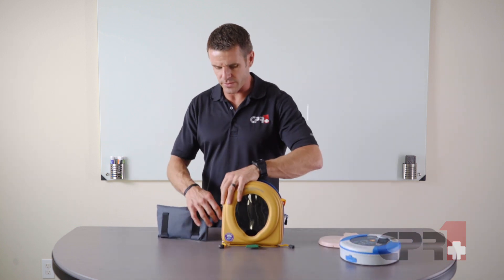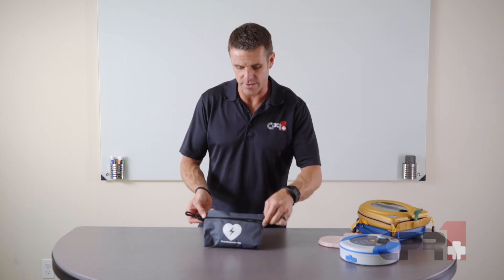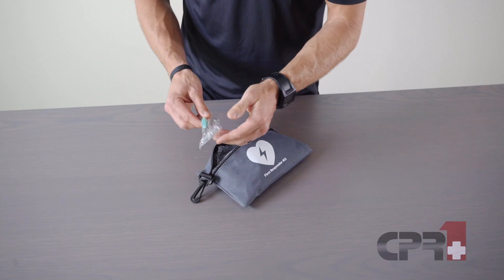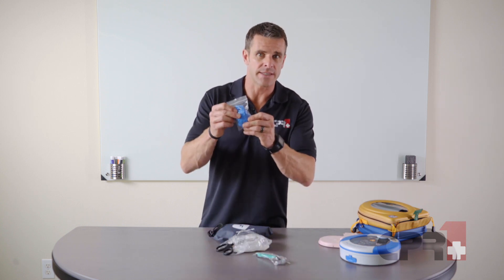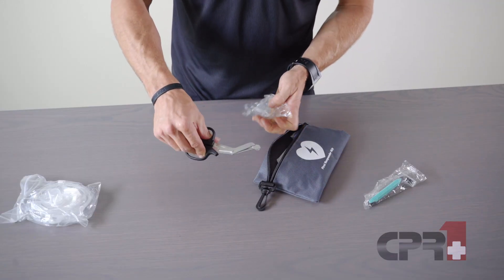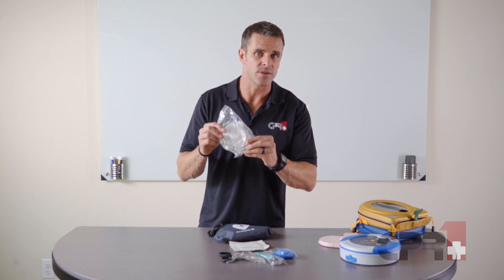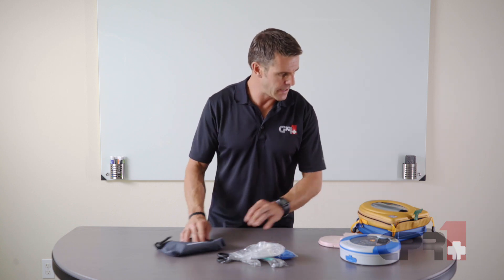Attached to the AED, we're always going to have a first responder kit. These typically have the same sorts of supplies regardless of the kit type, and it's always going to include a heavy-duty medical-style razor to shave the areas on the chest where the pads go if needed, a set of non-latex gloves, trauma shears — also known as heavy-duty scissors — which can cut through clothing, underwire bras, jeans, and anything like that, along with a one-way breathing mask for protection during breathing and a couple of towelettes.